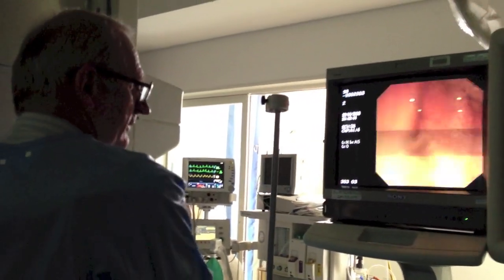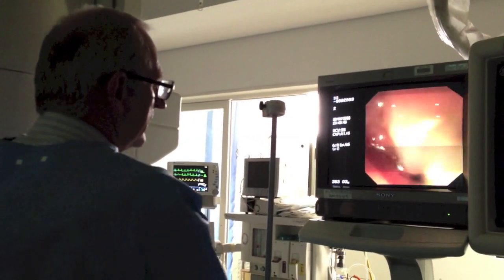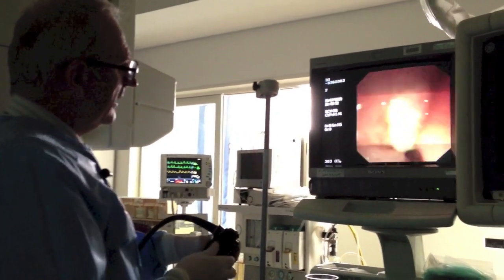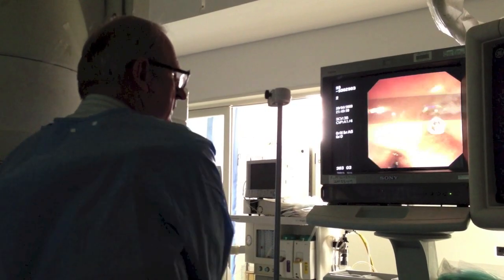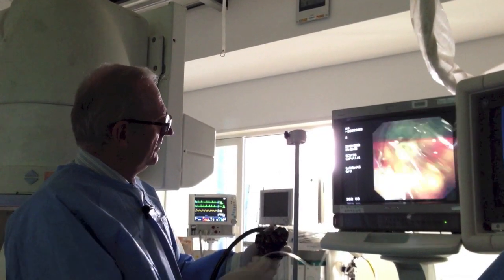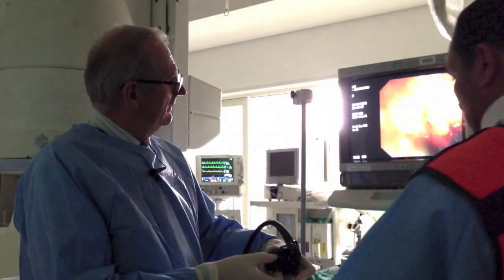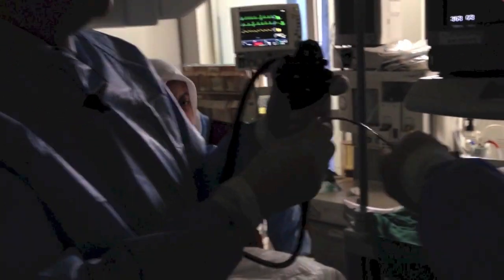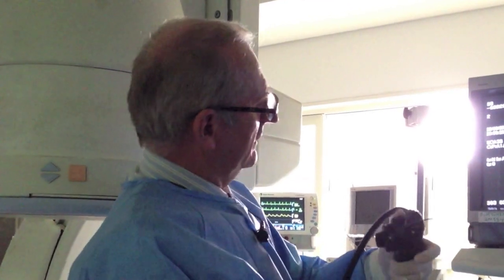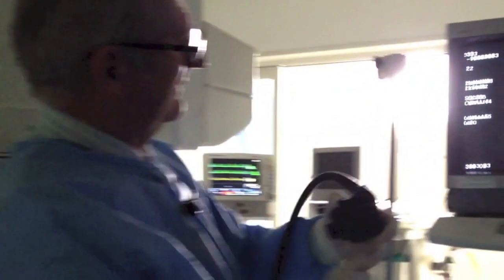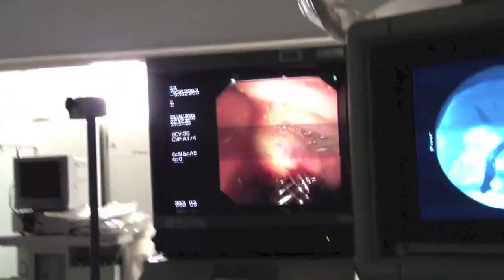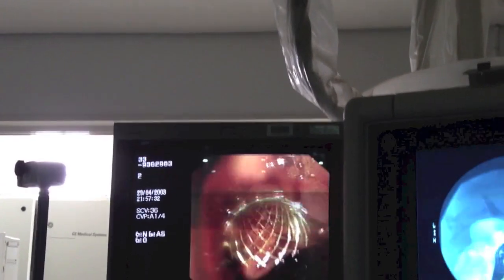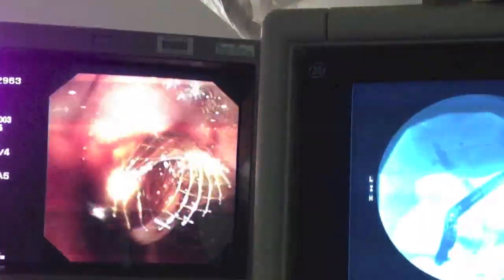This patient has had procedures before — they have a malignant stricture of the biliary duct. A plastic stent was previously inserted to make a free bile flow and relieve the obstruction. Now we are going to change the plastic stent. First, we try to remove the plastic stent — you can see the blue outer part of the stent. Now I remove the stent and we are inserting the new stent over the wire. You can see the stent on the endoscopic picture. Now the stent is inside; we release the stent. Now we can see the metal stent outside of the ampulla — it's in a proper position with good flow. Thank you very much.